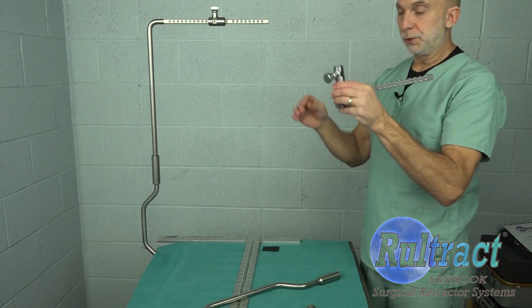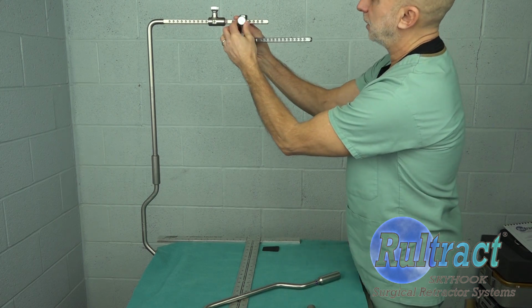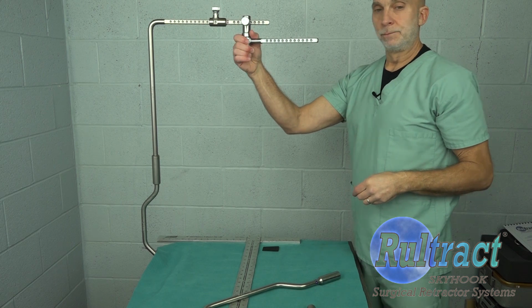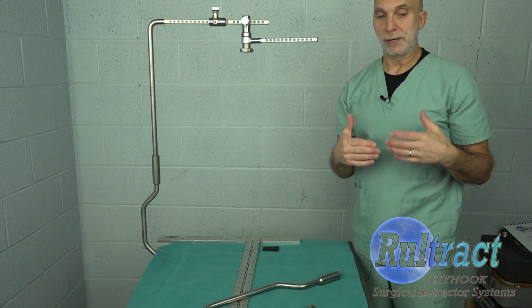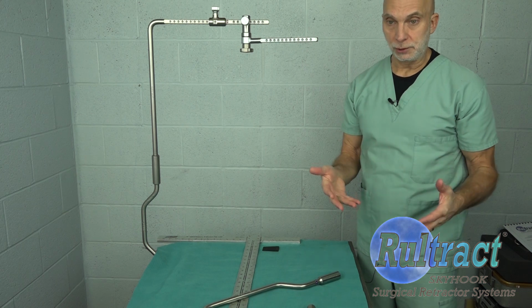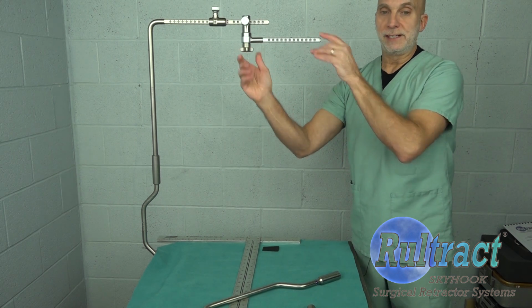So as we go ahead and put this into position, make sure that it's aligned between the alignment marks and go ahead and tighten it down. Now you can rotate it 360 degrees to make sure that you're going to get the correct angle of retraction for the specific part of the procedure that you are doing. Once you have that, go ahead and lock that into place.